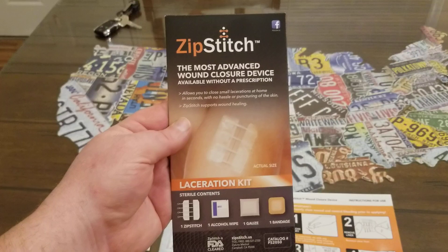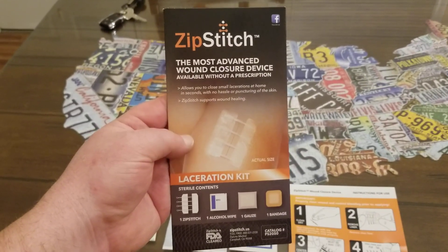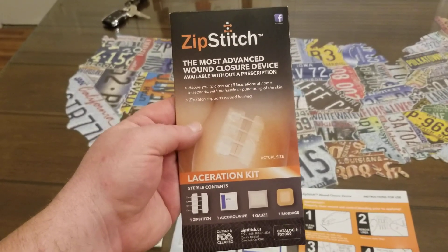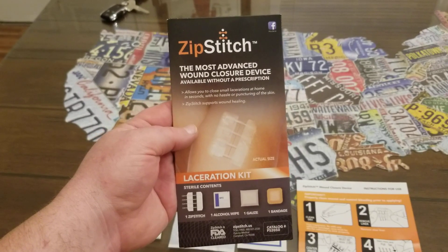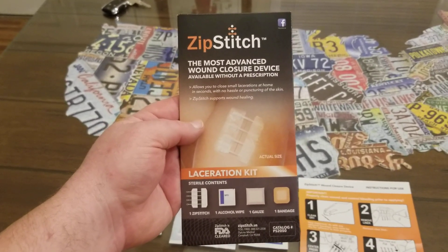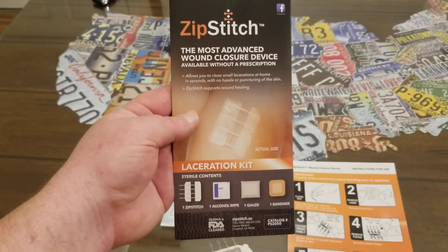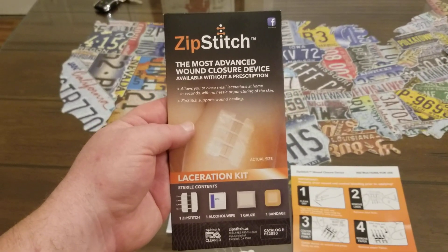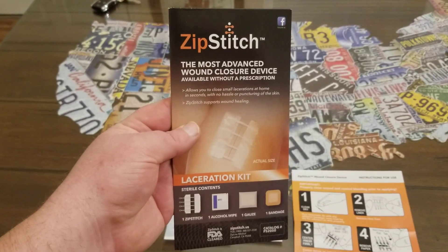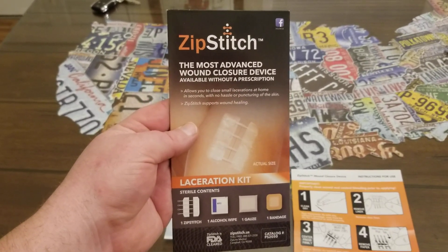I wanted to tell you about this product because it might help you in an emergency or save you quite a bit of money on an ER visit. This product is a way to close a wound — a small wound, like an inch and a half long or smaller. It's not going to work if you cut your leg off or anything like that, but if you have a pretty small wound, inch and a half or smaller, this will definitely work.